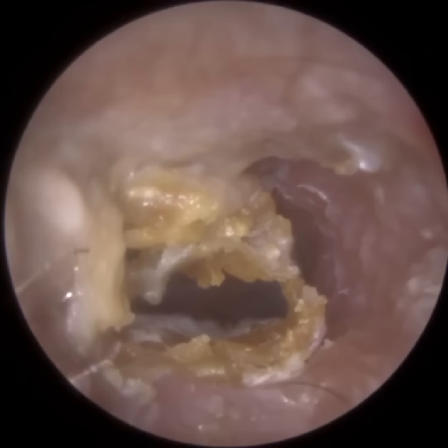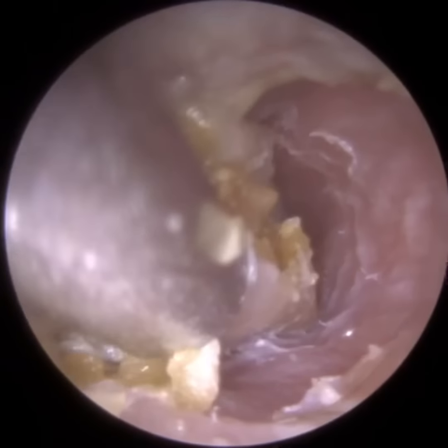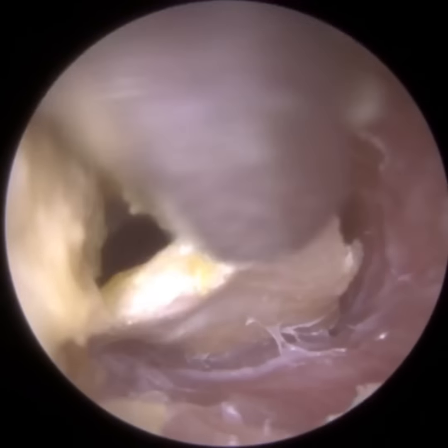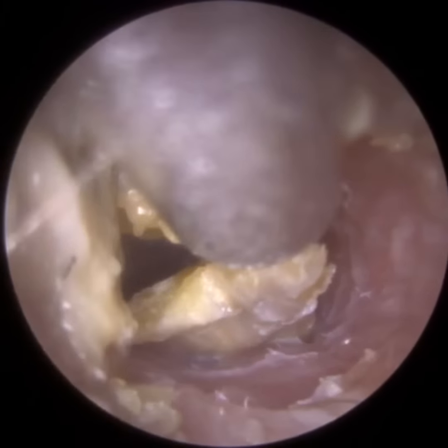So then I'm going to use the suction probe again. You can see with the sucker there's very limited space there. It's just blocked the suction probe. It's just trying to peel it off the front part of the ear canal. And then I think I'm going to go to the roof of the ear canal and peel this plug of skin downwards. There we are.